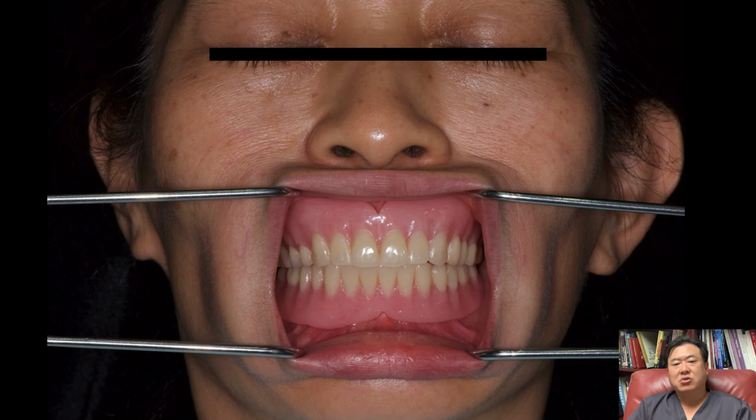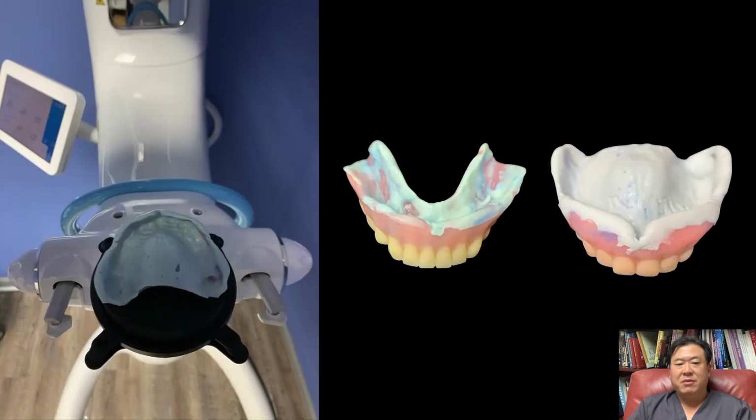She wore this denture for a couple of months and her gingival tissue healed and her alveolar bone remodeled a little bit. PVS wash impression was made with her denture and they were digitized with impression CT scan, which comes with R2 Studio CT scan.